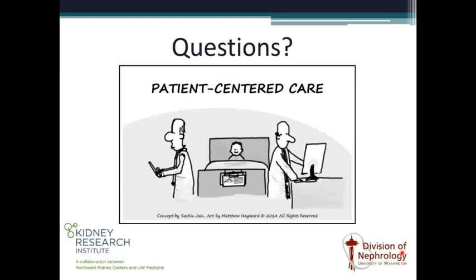But is there any technology, for instance, people can buy these monitors for their iPhone that record their heart rhythm. Is there a technology that's developing so that a patient can actually buy an ABPM type of technology and then transmit it to their physician? Yeah, they're not as good or small as the ABPM devices, because it's still the size of a monitor that you can't really wear. So it's got to be on the bedside table, but they do have devices that connect by Bluetooth, upload to your phone, and you can send that to your doctor.